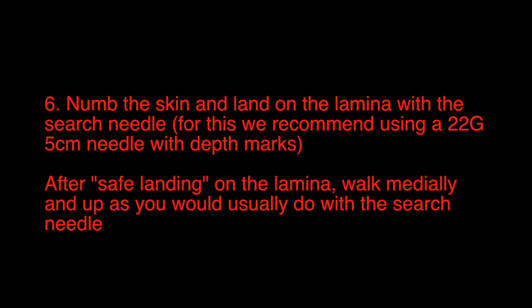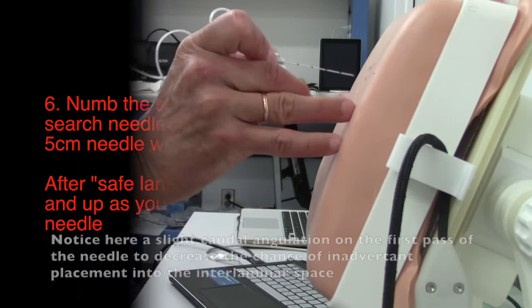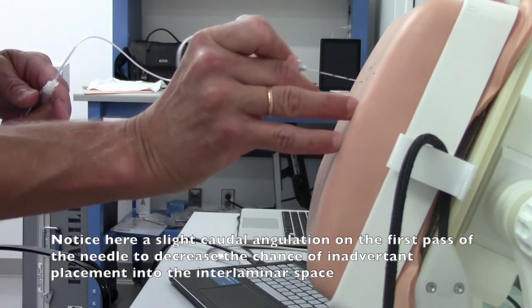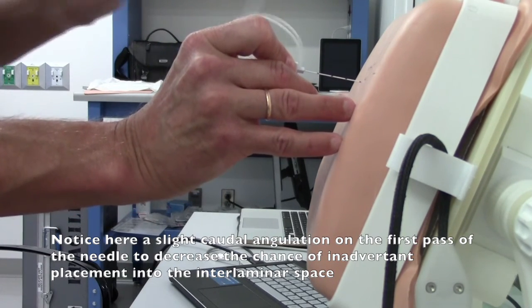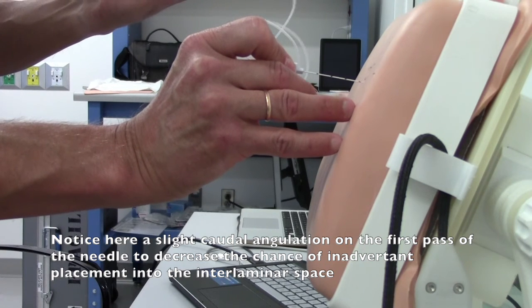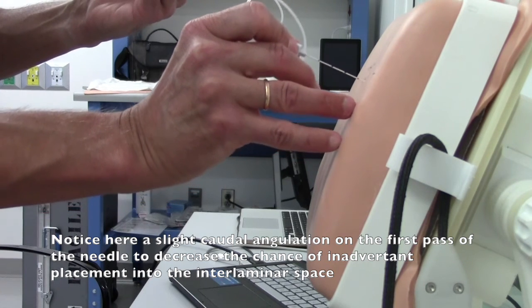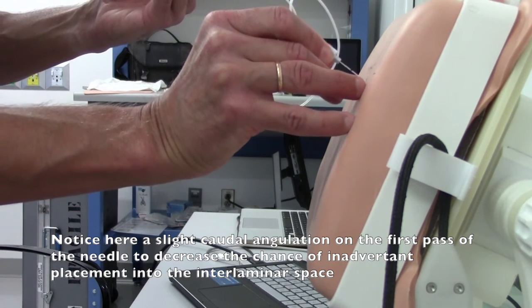Step 6: Numb the skin and land on the lamina with the search needle. We recommend using a 22 gauge, 5 cm needle with depth marks. After safe landing on the lamina, walk medially and up as you would usually do with the search needle. Notice a slight caudal angulation on the first pass of the needle to decrease the chance of inadvertent placement into the interlaminar space.